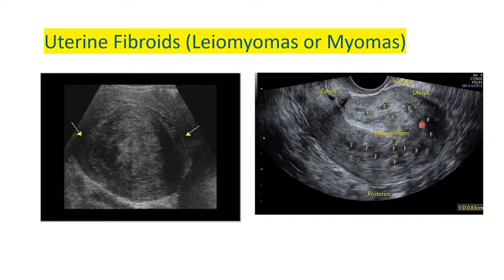But to me, look here, you can see there's a cesarean niche there, meaning that this patient had a cesarean section. That's a cesarean scar there. And if you look at the endometrium closely, it is very much indistinct.